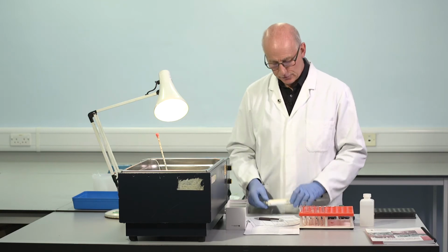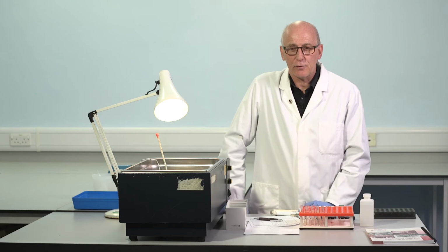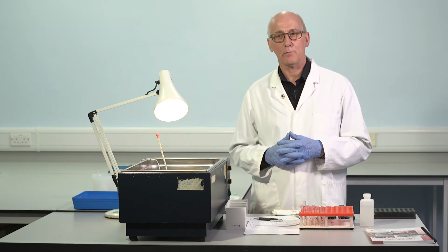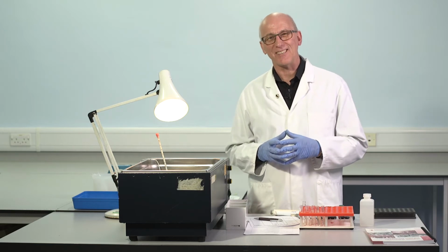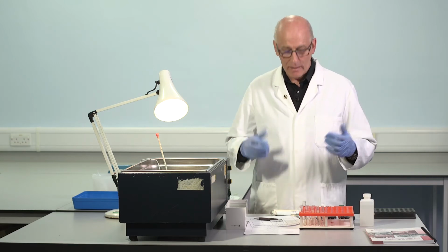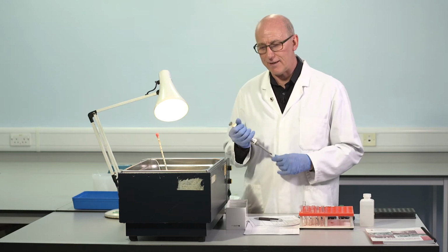So why 3 test dilutions? 2 reasons. One relates to the precision. There are several publications which have looked at the precision of factor VIII assay results and shown that there is much better precision, much closer agreement between results obtained in different centres if centres use 3 test plasma dilutions. So for example, we ran a survey through our proficiency testing programme and we asked people, how many dilutions do you use in your factor VIII assay?